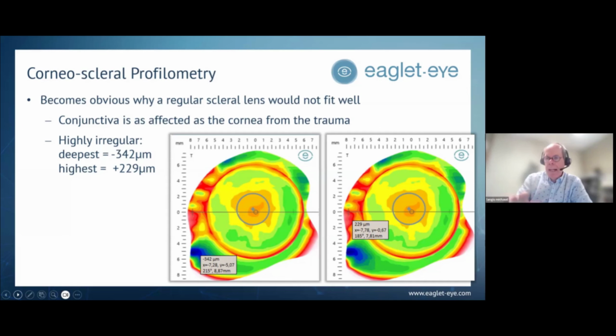Even if I didn't know a single thing about that case before, I have this patient in front of my chair and I look at my options. So I scan, I do my profilometry, and from there, if I'm considering sclerals, I'll be in trouble, because except if I go with molded lenses and complicated procedures, I have to go elsewhere. So piggyback, small gas perm, hybrids, and then it clears the option.